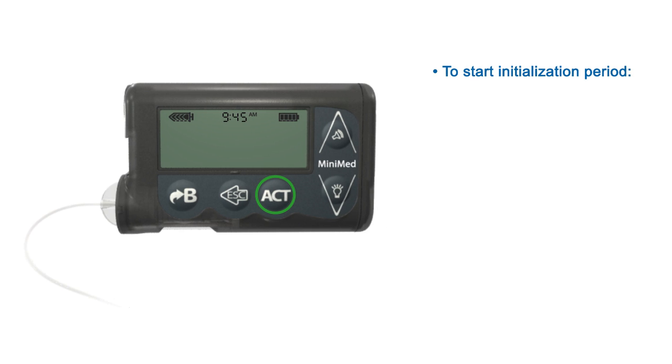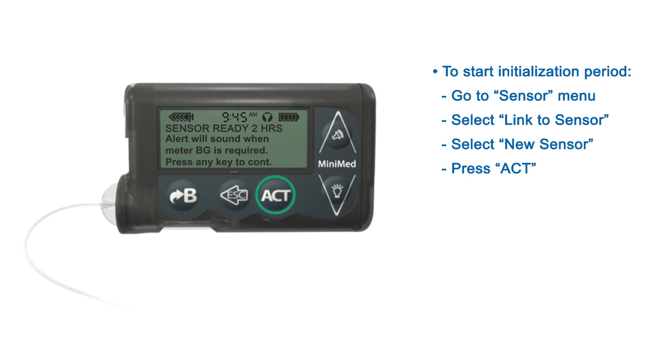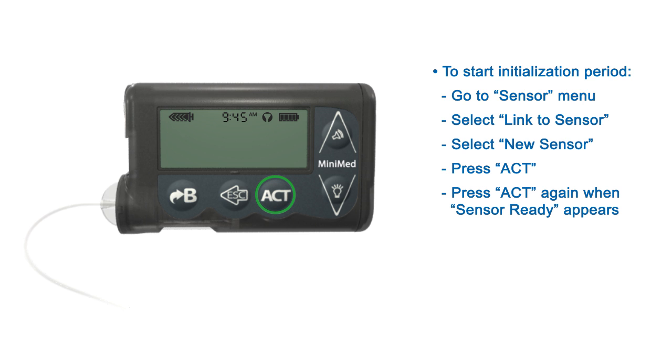To do this, press ACT from the home screen. In the main menu, select Sensor and press ACT. On the sensor menu, select Link to Sensor and press ACT. New Sensor will be highlighted — press ACT to select it. The new sensor screen tells you to connect the new sensor to the transmitter. Do this now if your sensor is not already connected, then press ACT. Press ACT again when the Sensor Ready message appears. Your pump will alert in about 2 hours when it is time to enter your first calibration.